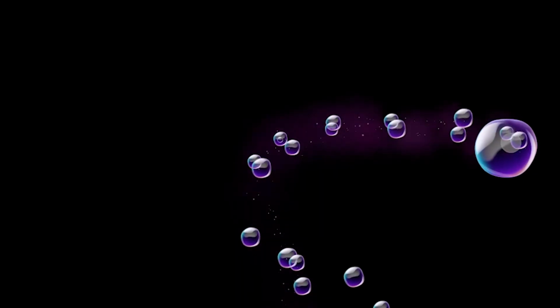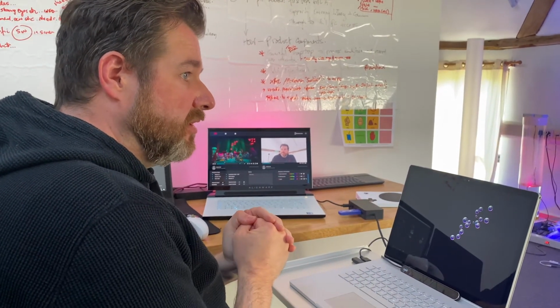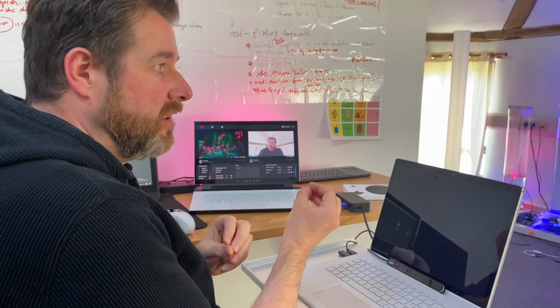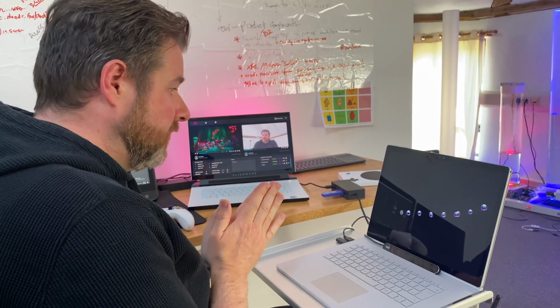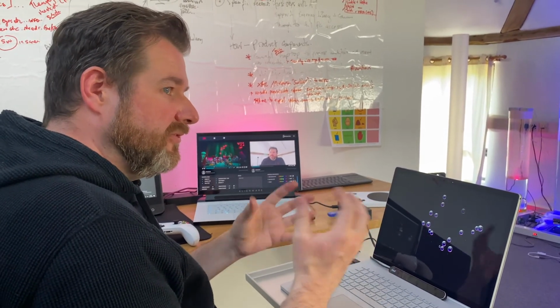So obviously here, to interact with it, we would need to look at it for that period of time. And as we start adding more and more complex things into a scene, it's not just this simple figure ground concept. You want people to spend more time observing the scene and focusing and fixating on certain parts of that. So this is a way of using dwell as an attention tool as well as just an activation method. So a whole bunch of different ideas there, and this is how we work with the content within iFX. Everything is integrated into every app, basically.